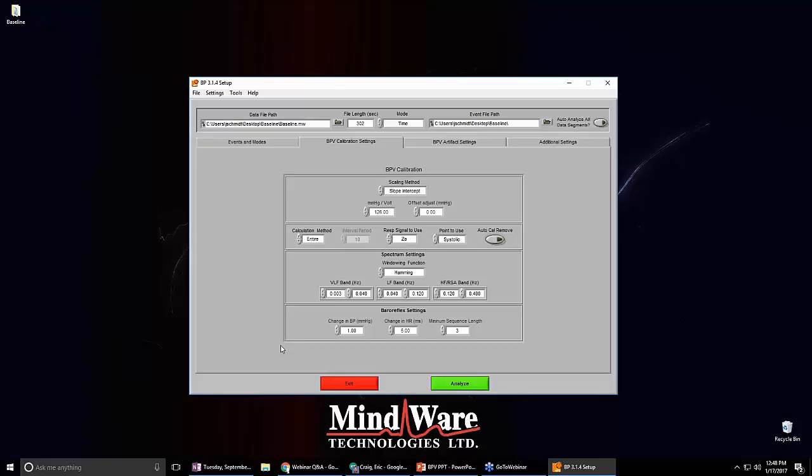If you had any scientific questions, I would recommend a good place to start would be the Handbook of Psychophysiology, which you can purchase through Amazon. So those are all of our BPV calibration settings.